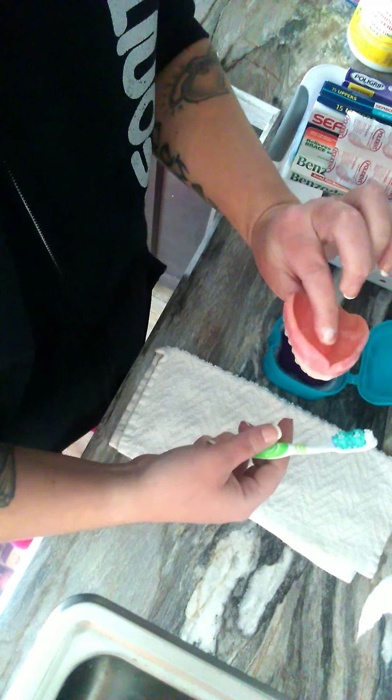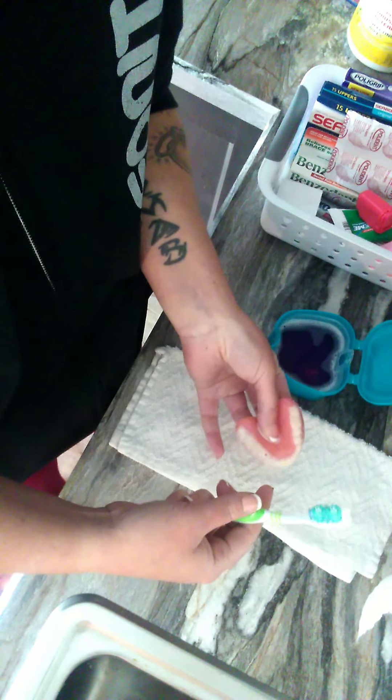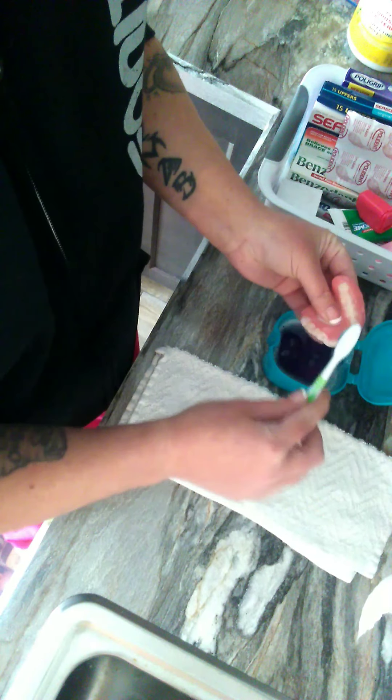When I hold my denture, I hold it like this, or I put my two fingers in here and it prevents it from falling. So you scrub really well.